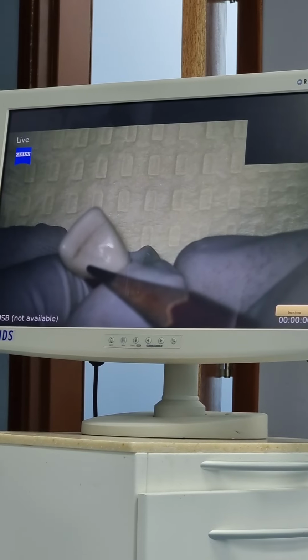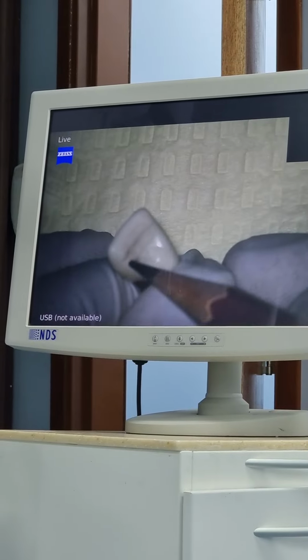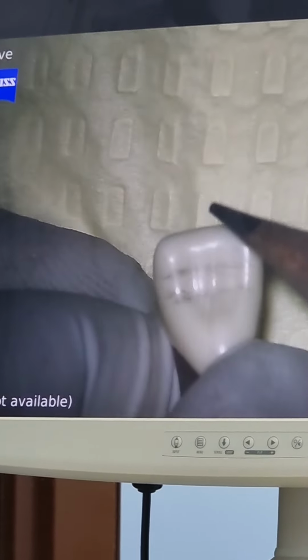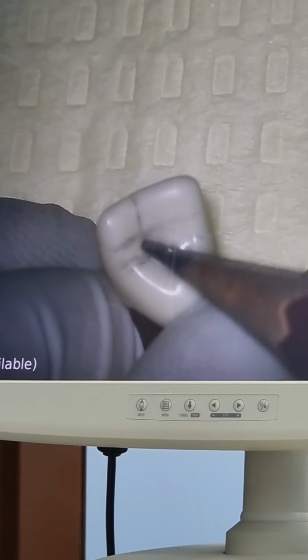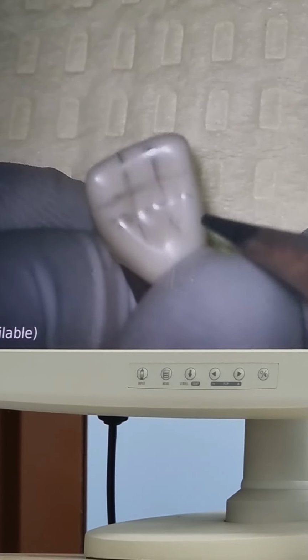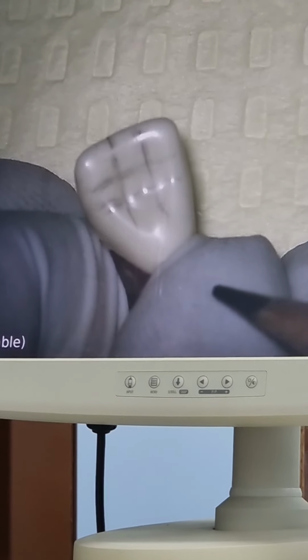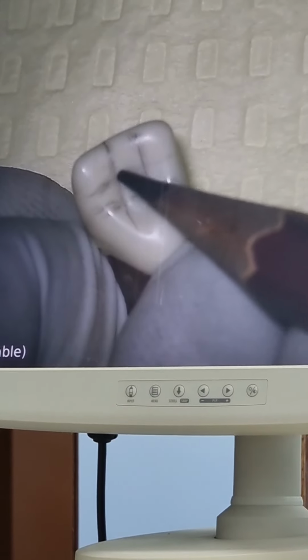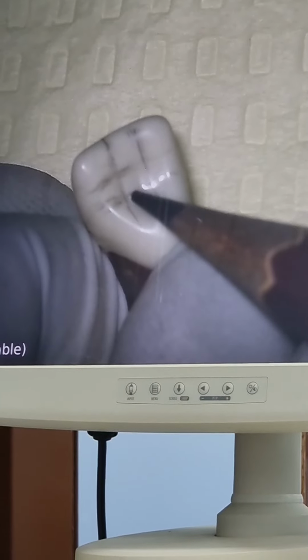This is the first horizontal line, the second horizontal line equidistant, and then we will draw two vertical lines equidistant. Okay, so I have this lingual surface divided into nine parts. So our area of concern is this central part, the center of the lingual surface.